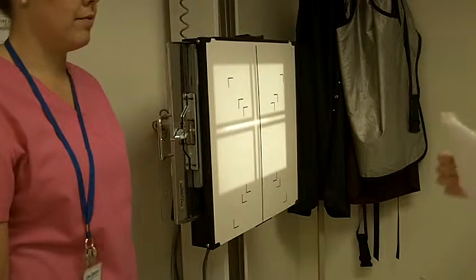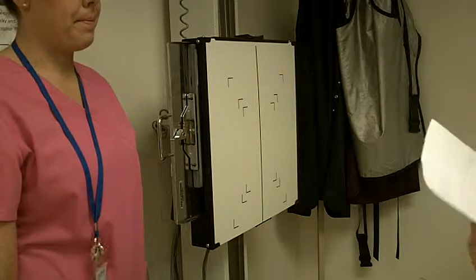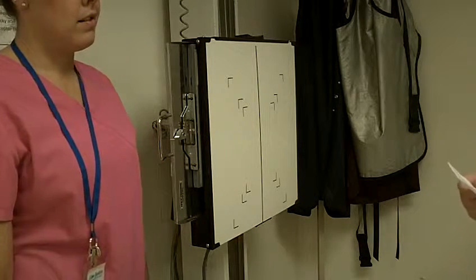Hi Kelsey. My name is Megan. I'm going to be taking your x-rays today. I just need to verify your full name and your date of birth before we get started.